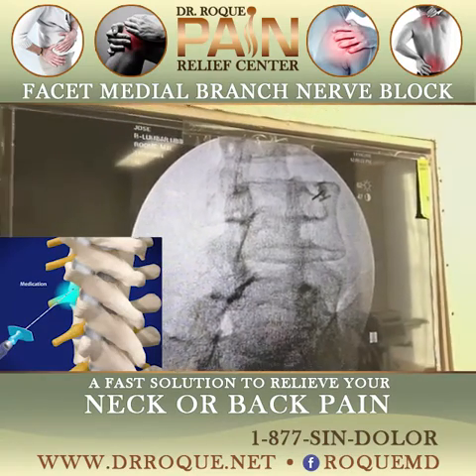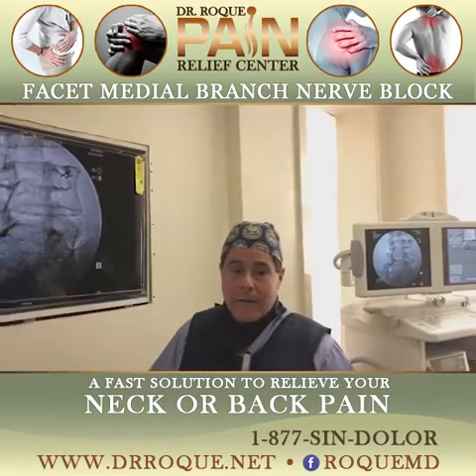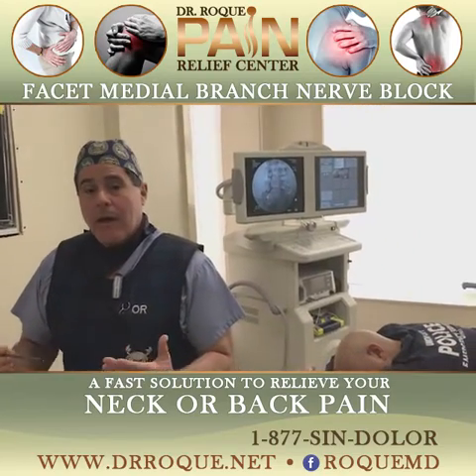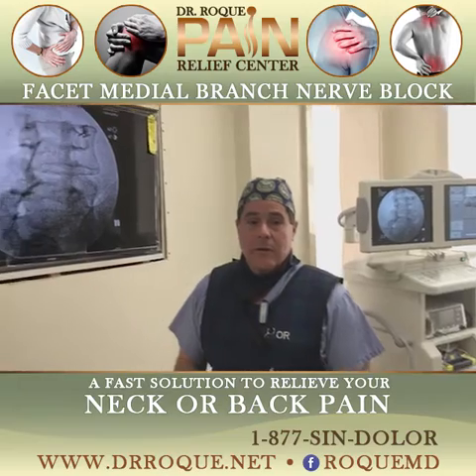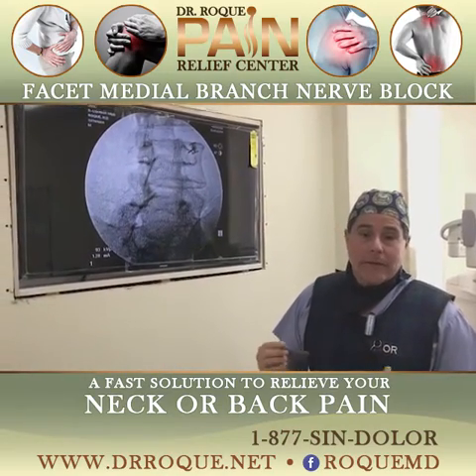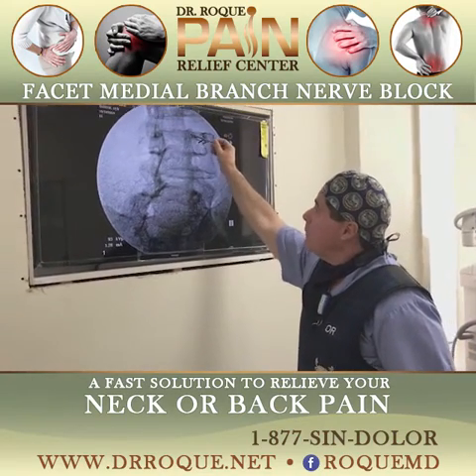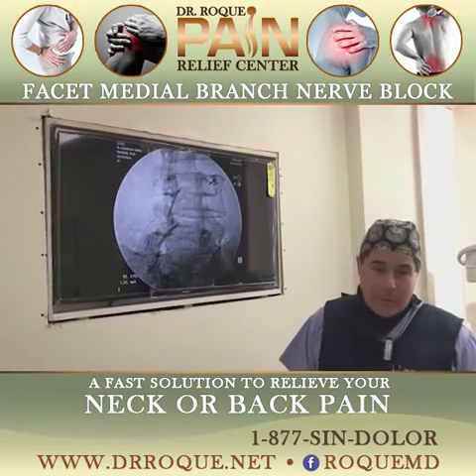Now what is the purpose of the anesthetic? The anesthetic is going to block the right-sided L3 medial branch nerve. And if the patient gets relief for approximately four to six hours, then he's going to get much better, and I'm going to be able to know that that's the affected joint — the joint where he's got the degeneration, or the arthropathy.